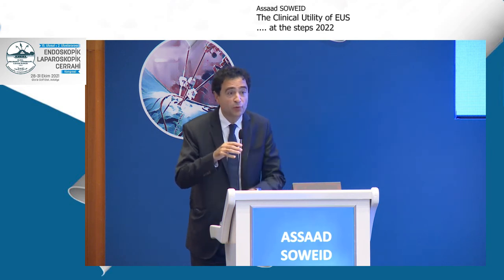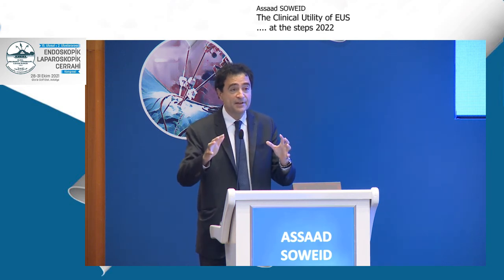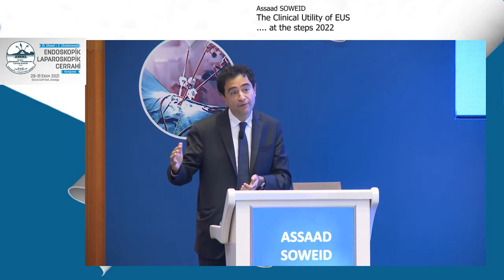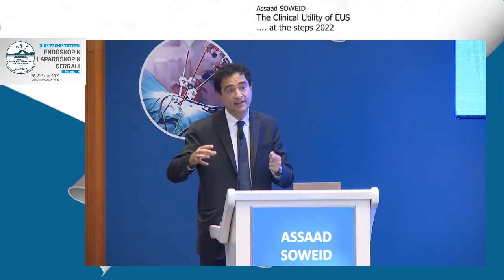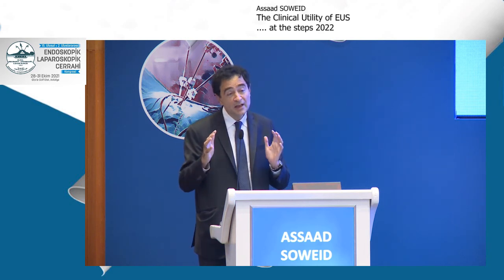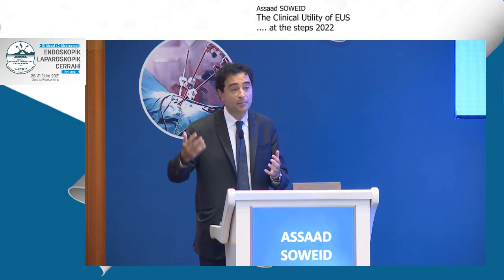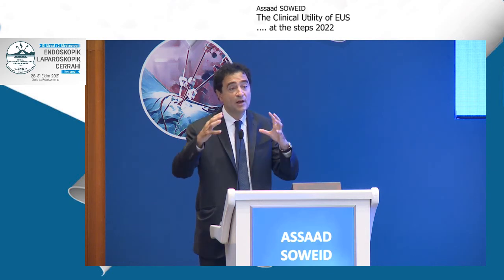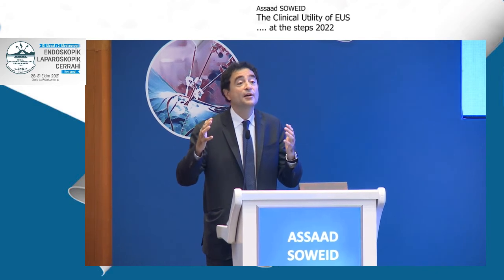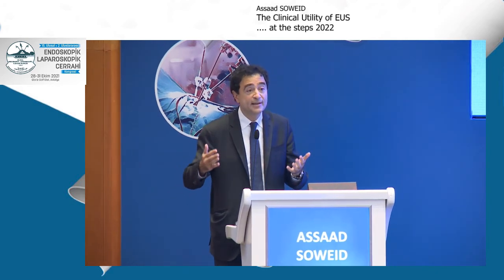Thank you very much for the question. So, first of all, there is definitely a difference between a pancreatic pseudocyst, which is only water-filled, and a walled-off collection necrosis that is very thick with a lot of material. So let's start with the pseudocyst. If we can tell a priori if this is a pseudocyst by MRI, ultrasound, etc., and if we decide it is a pancreatic pseudocyst and it's symptomatic and it's mature beyond 4 weeks, yes, we have to drain.